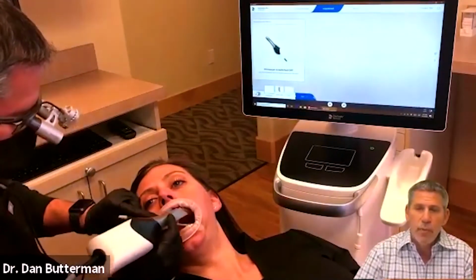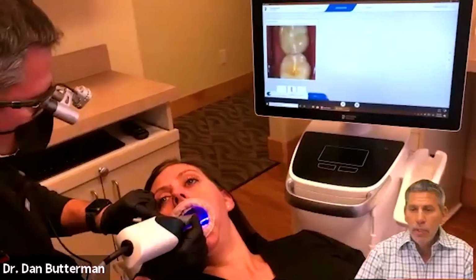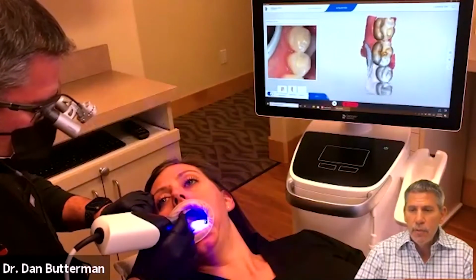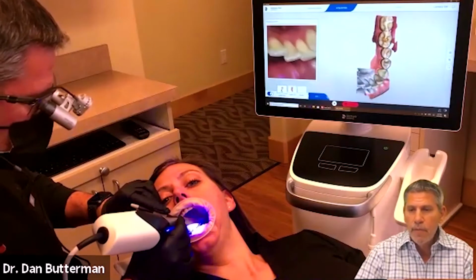So we just imaged the upper arch. We'll now do the same thing on the lower arch, and we'll start scanning here. And you'll see that as I'm scanning and coming around to the anterior area, we're just going to start to pick up part of that lip.